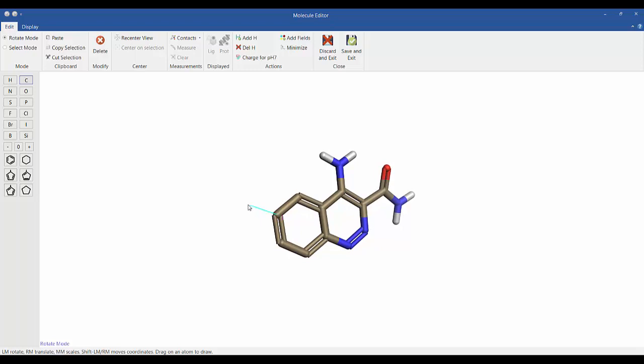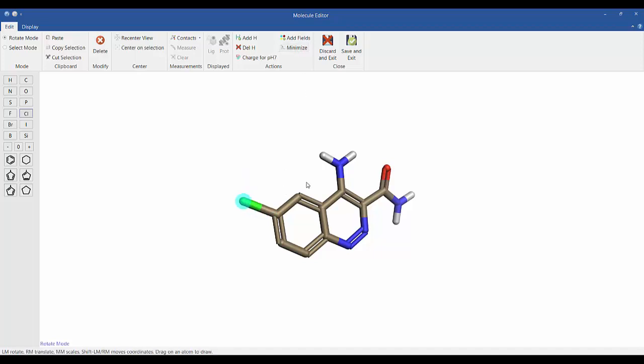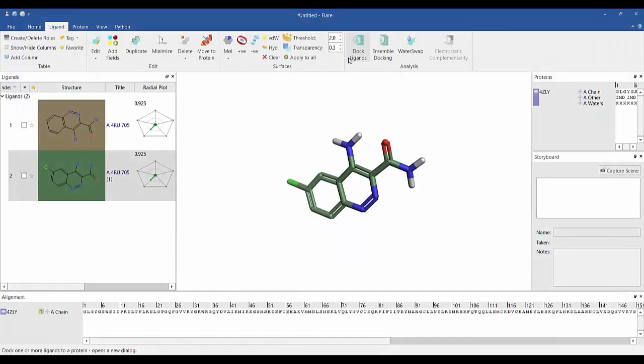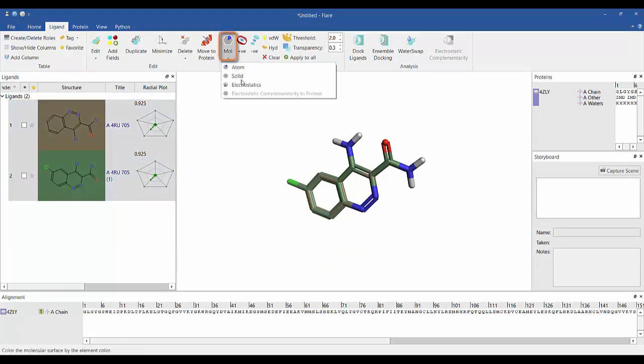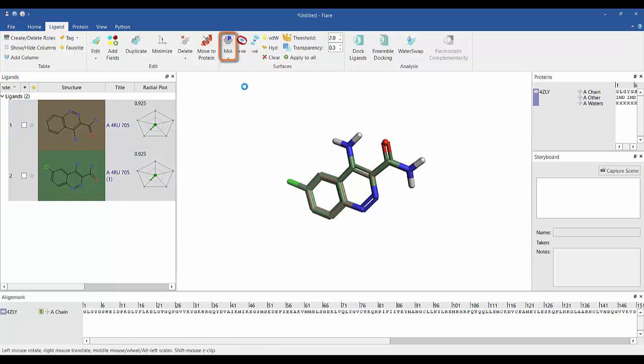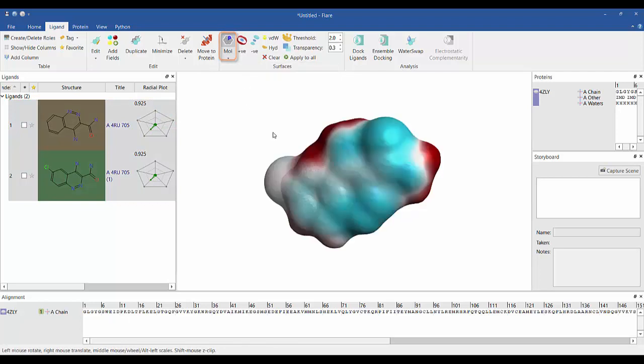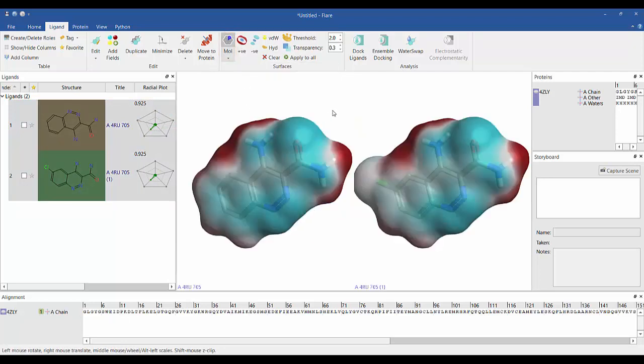The ligand or a user-defined part of the ligand can be minimized, ensuring bonds, angles, and torsions have low energy values. We can also project the field surfaces onto a molecular surface on both molecules and compare them side by side using grid mode.